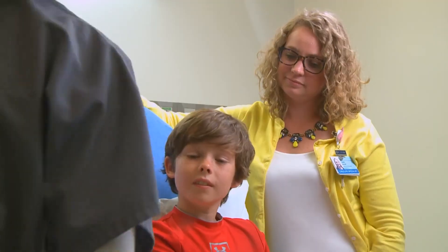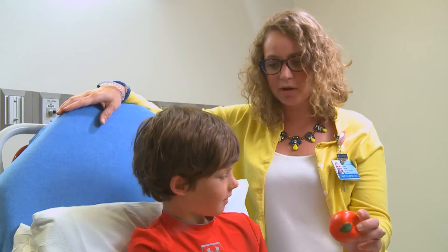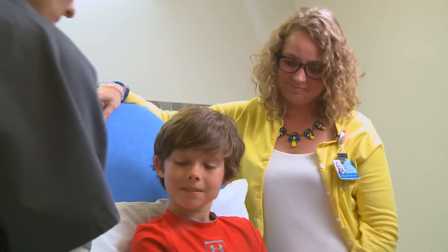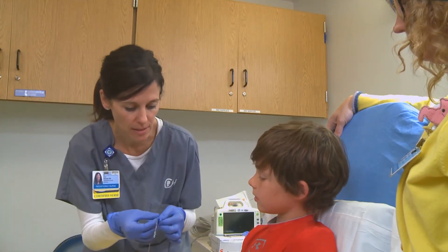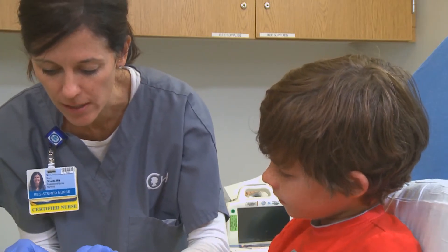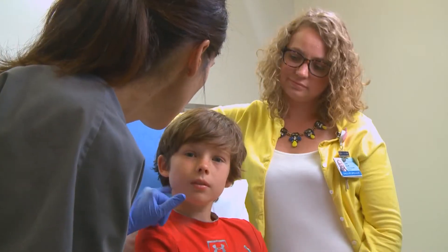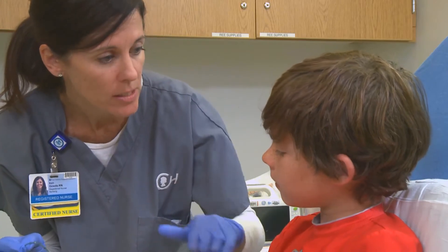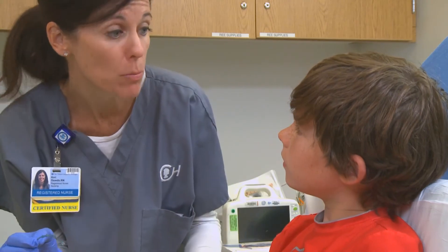Just give me a few minutes as I get myself together. Remember, just like we talked about, your job's going to be to squeeze on the stress ball and take nice big swallows while nurse Carrie puts that tube in. It's a really, really thin probe — not even as fat as spaghetti. I'm going to help the probe slide in. We're going to put it in your nose and it's going to go down into your esophagus. Once it's where we want it to be placed, we're going to put the special tape on the side of your cheek to keep the probe in place.